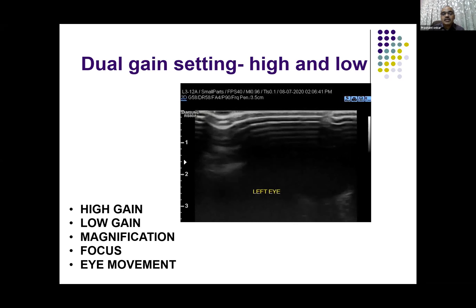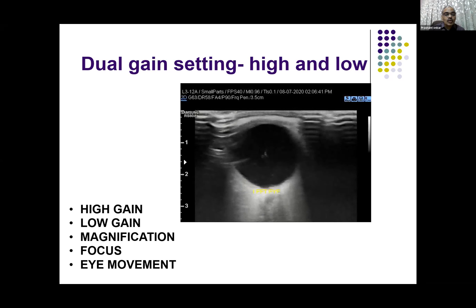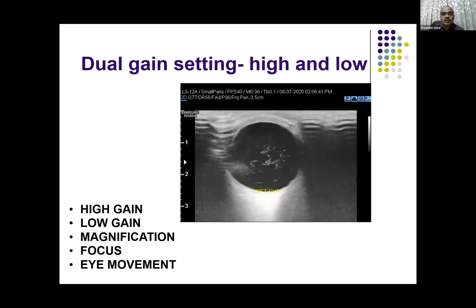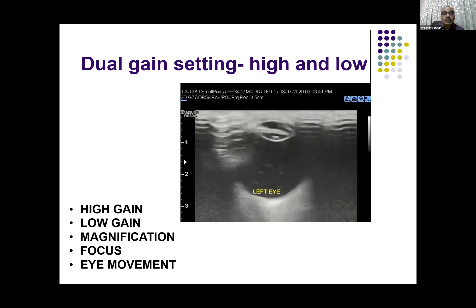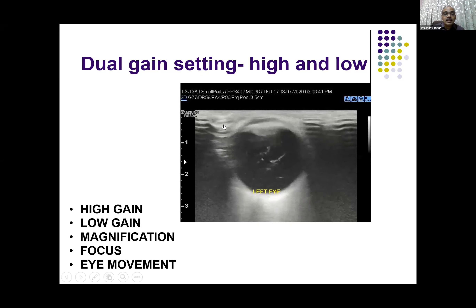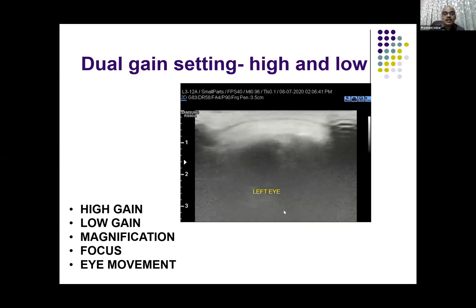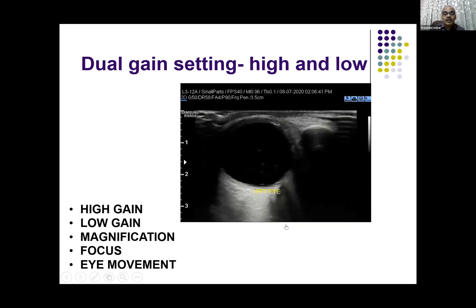And in low gain, you can see the posterior vitreous, retina, optic nerve, and muscles also. You have to use proper magnification so that the eye is seen in almost 50% of your screen. You can use the focus at a very near range — between one to two centimeters. And you can use eye movement to see whether the contents are movable and how is their movement.